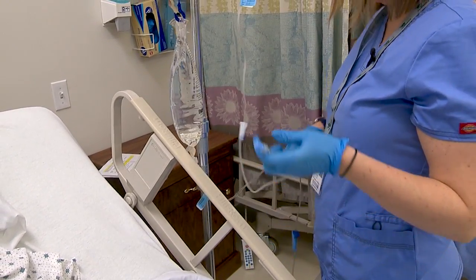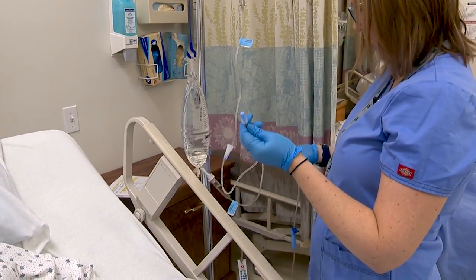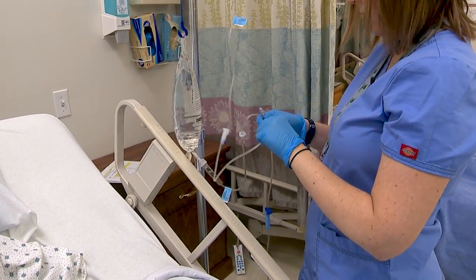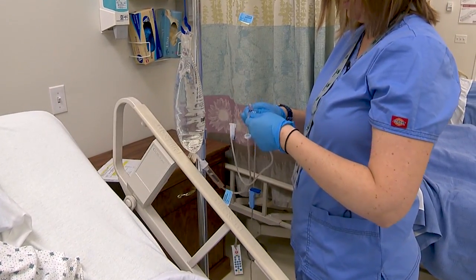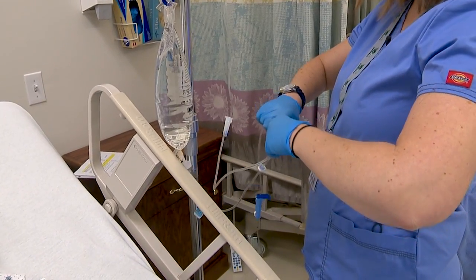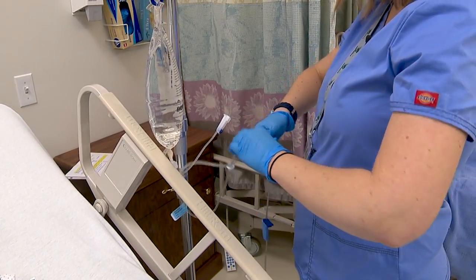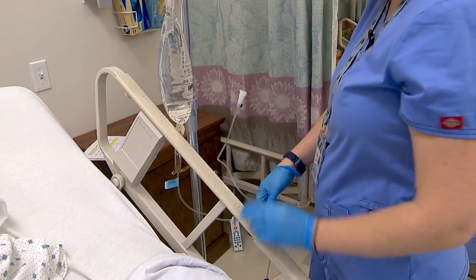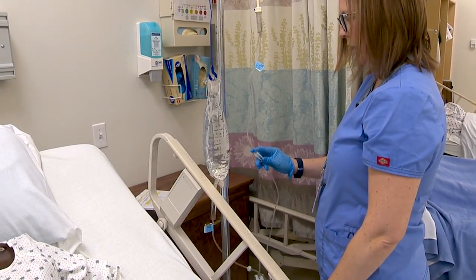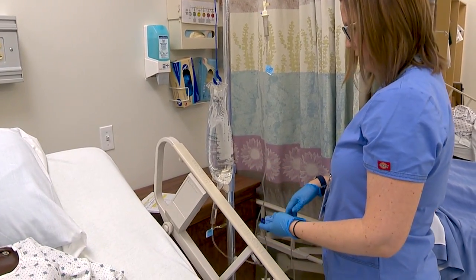And I'm going to make sure that my tubing looks okay again. Everything's primed. The primary's primed, secondary's primed. There's no air. And then going to carefully connect the two together, push and screw again. Okay, good. Then I can go ahead and open up the clamp on my secondary tubing, and I'm going to control my drops with the primary roller clamp.